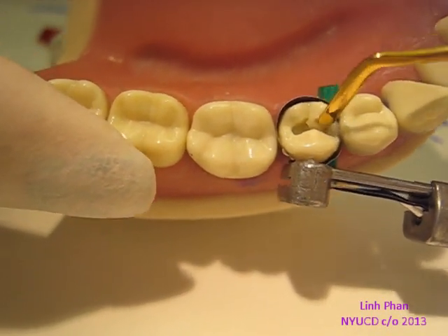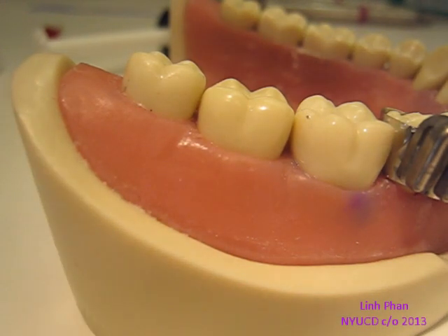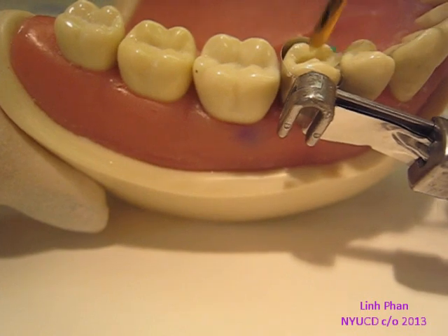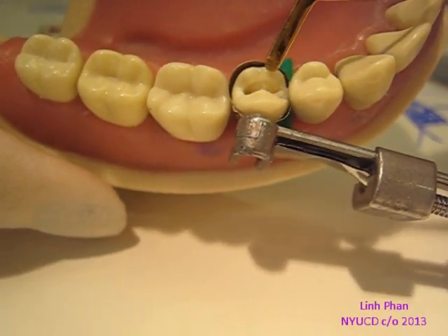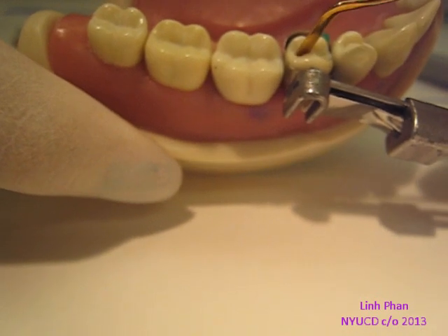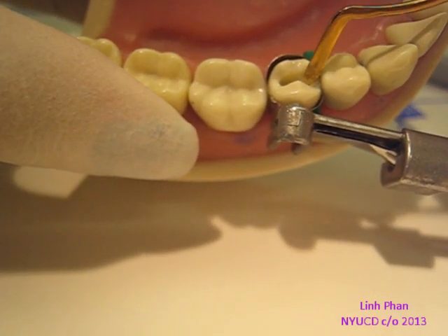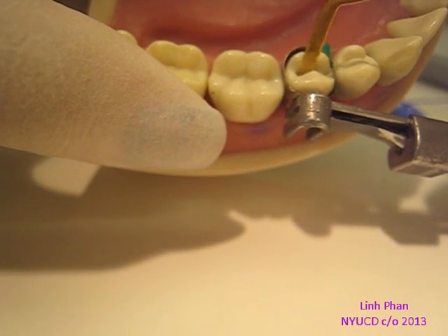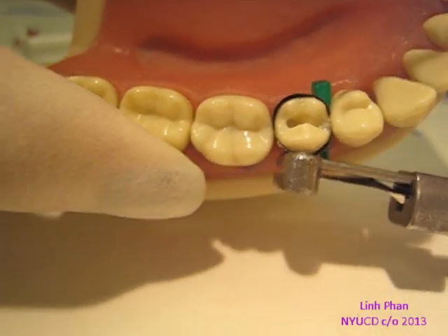I start by putting it in — I think I'm going to need a little more. Just enough to fill the groove and make the rest of the cusp. I'm going to use the cusp as guidance and try to shape it to the cusp. I'm using it and pushing it against the cusp and trying to shape the composite. You can keep playing with it and it'll start taking the shape of the cusp.